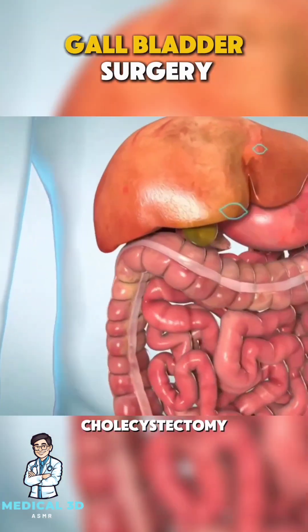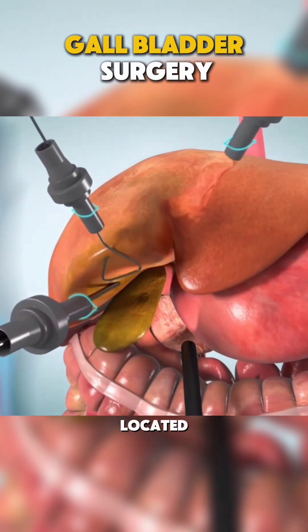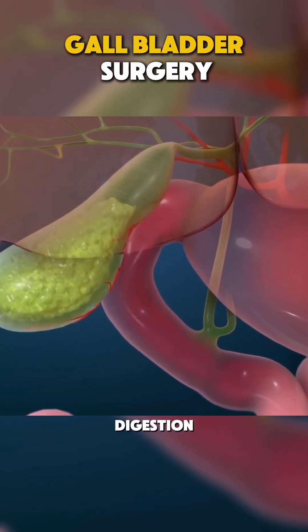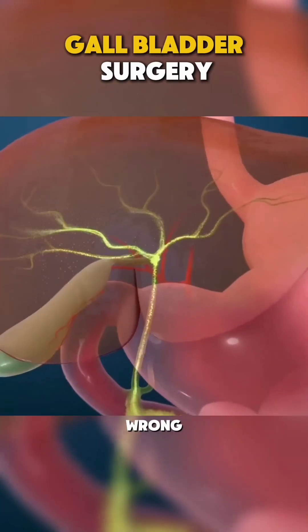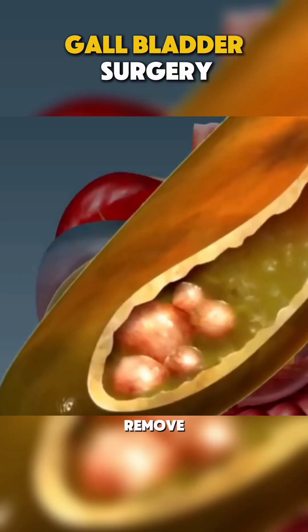Ever wondered how a cholecystectomy is performed? Let's break it down. The gallbladder, located just under the liver, stores bile that helps with fat digestion. But when things go wrong, like gallstones forming, a cholecystectomy may be needed to remove it.